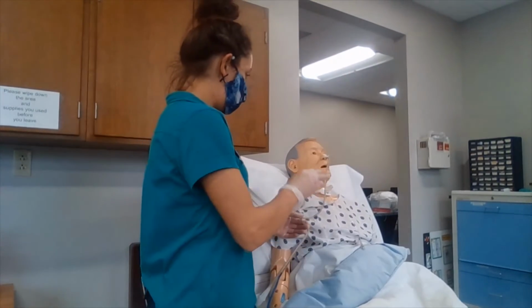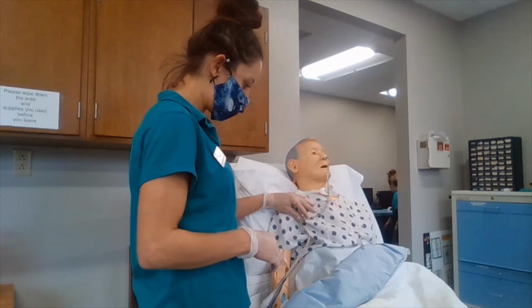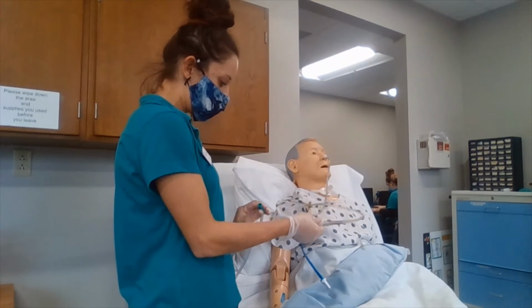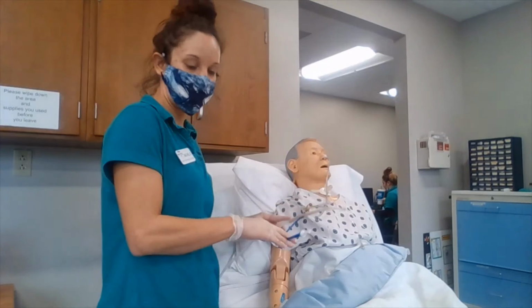So after verifying that our tubing is in place, we're going to make sure that it's secured to the gown. We are going to apply it to our suctioning device. We are going to then turn on the suctioning device to the prescribed amount.